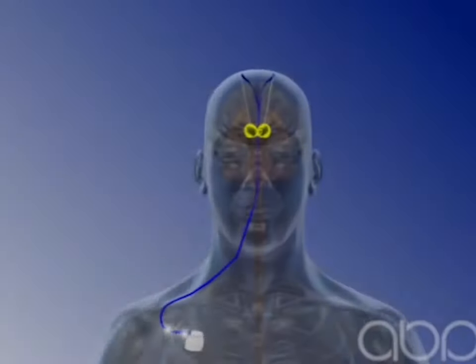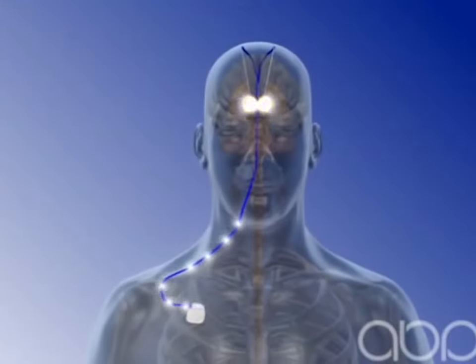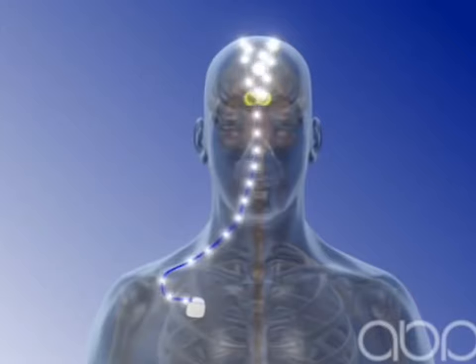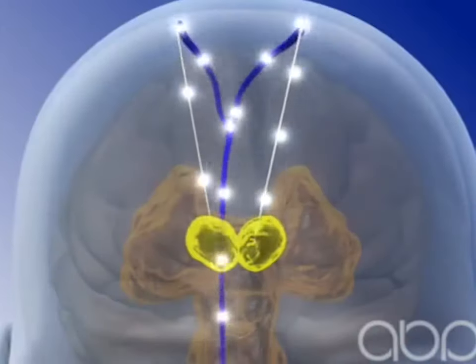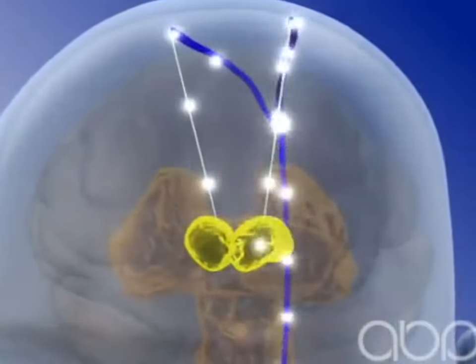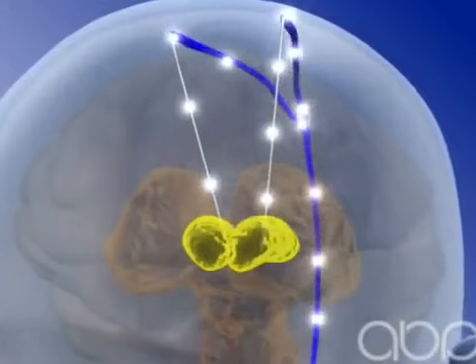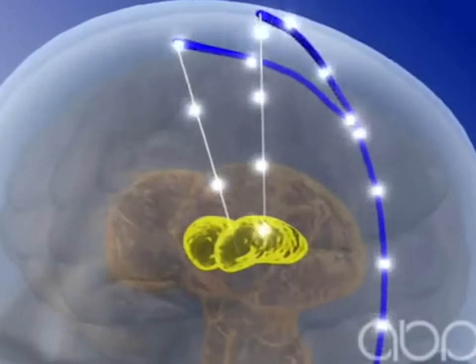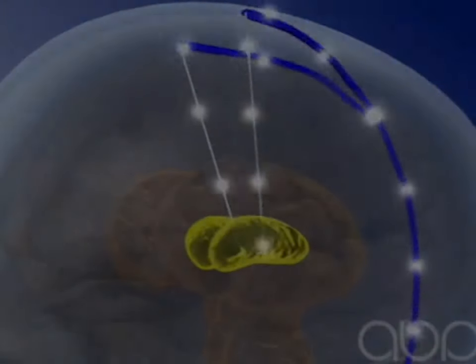Eureka takes the guesswork out of placing deep brain electrodes while simultaneously matching muscle tremors to tremor cells in the brain. This solution, when used in conjunction with imaging, will ensure patients are getting the best brain stimulation possible.